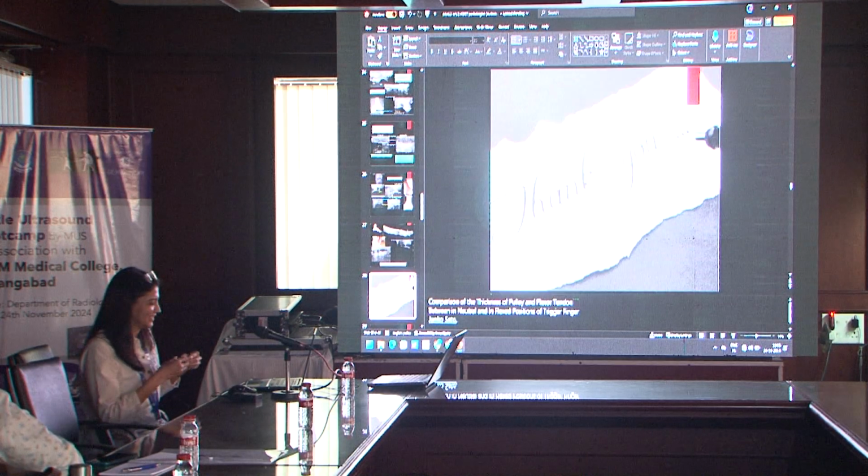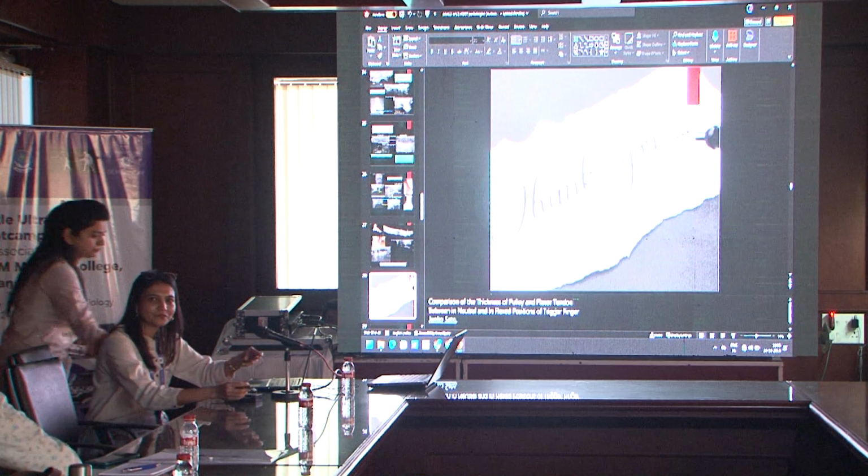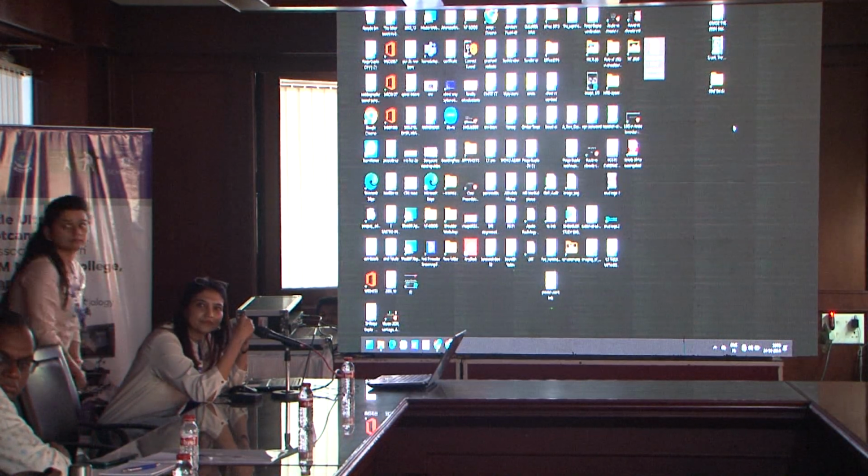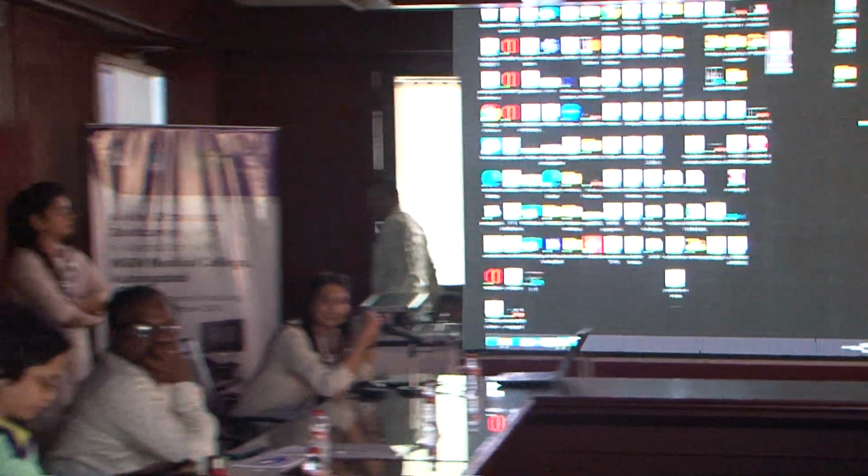The most important thing in the posterior, in Achilles tendinopathy, is that the normal tendon is flat, and if you have any pathology then it becomes swollen, or the capsule gets elevated. Absolutely, yes. Any amount of fluid more than 3 mm in any joint recess should be considered pathological. But then you should always compare with the other side. If both have the same amount of fluid, then it can be normal.